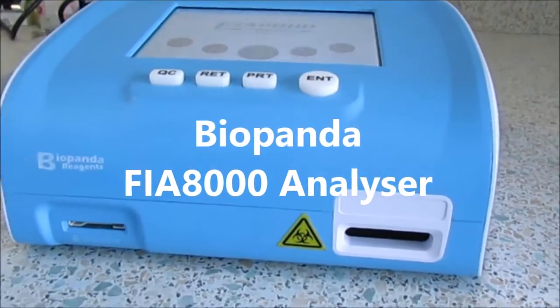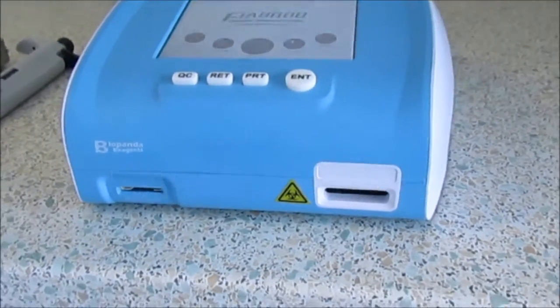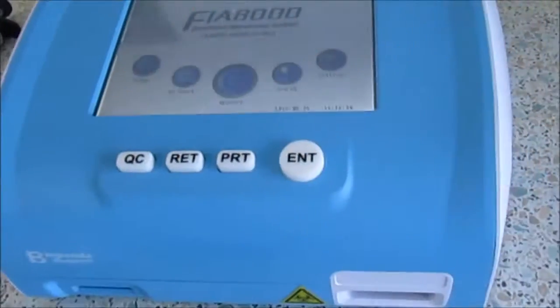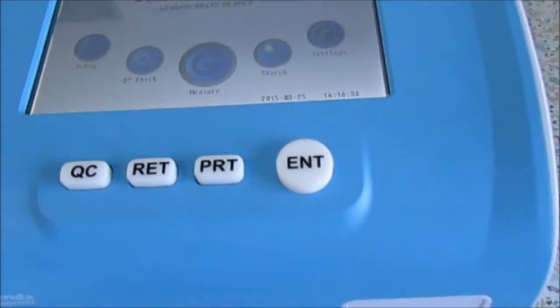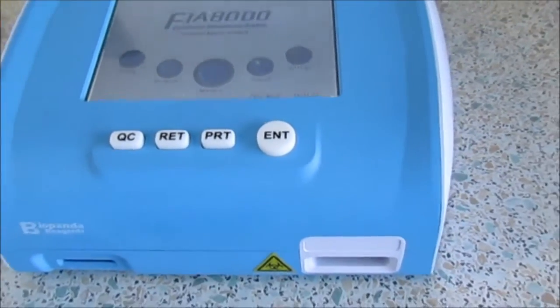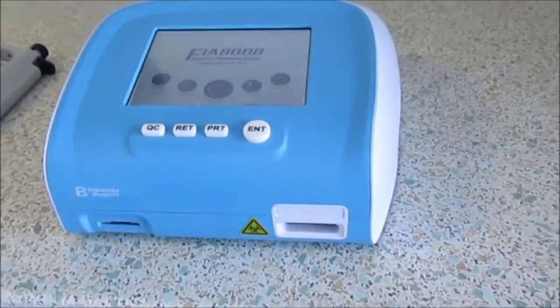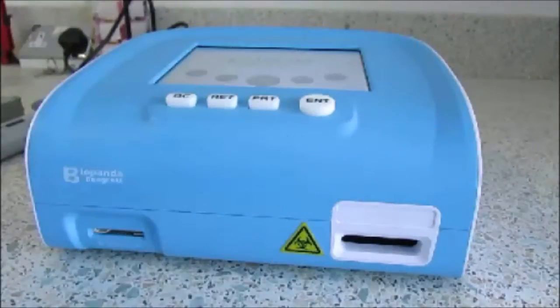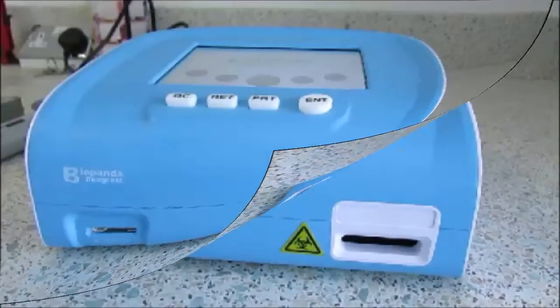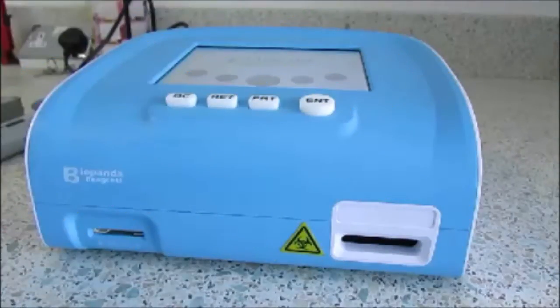The BioPanda FIA8000 Analyzer is a fast and reliable device used to test multiple biomarkers to assist in the diagnosis of cardiovascular disease, inflammation, renal disorders, diabetes, and for accurate early pregnancy detection. Results are available between 10 to 20 minutes, and its compact and lightweight design make it easily portable.